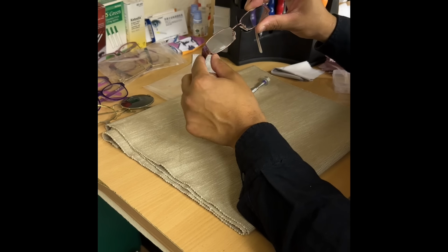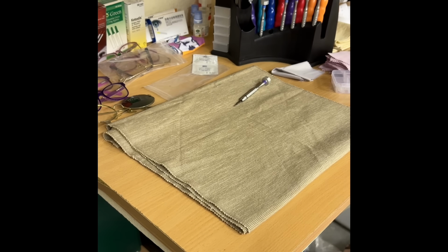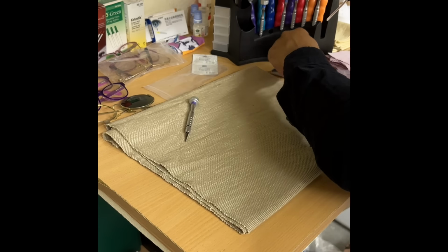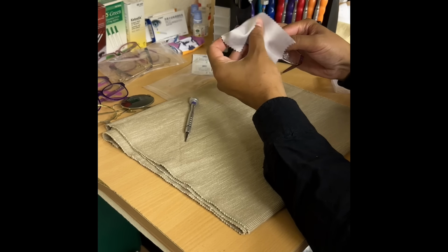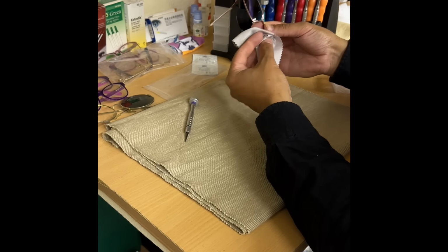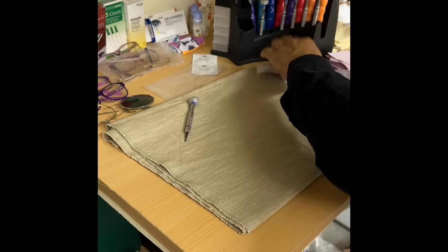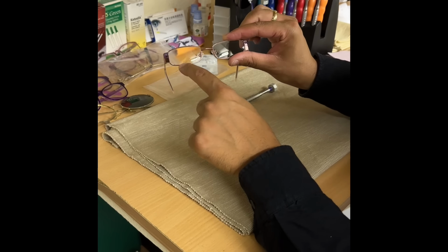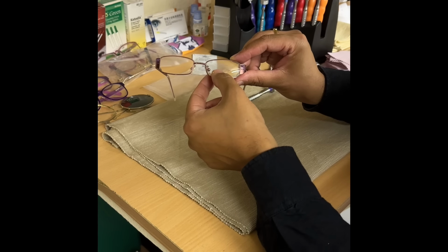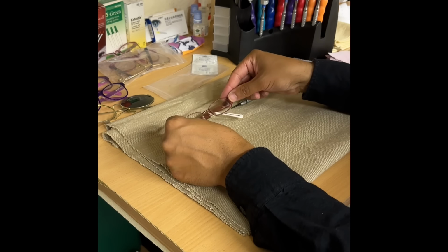Lenses, I'm going to need a little bit of a clean. Bear with me. Yep, as I thought, there are a few scratches on the lens. I'll show you an up close of that now. So as you can see, a few scratches there. So be careful when placing the frames down when you're not wearing them. Avoid this scenario, and fold the sides and place them down like so.